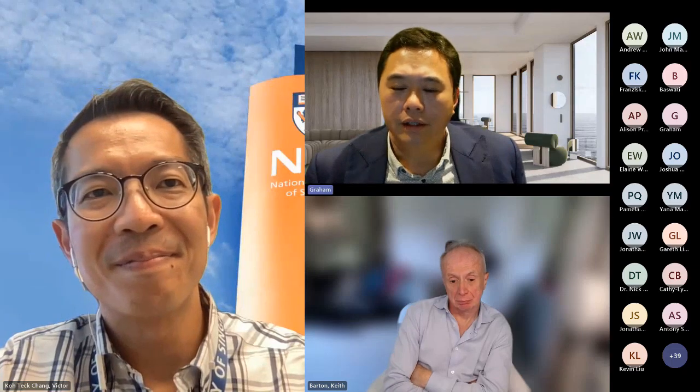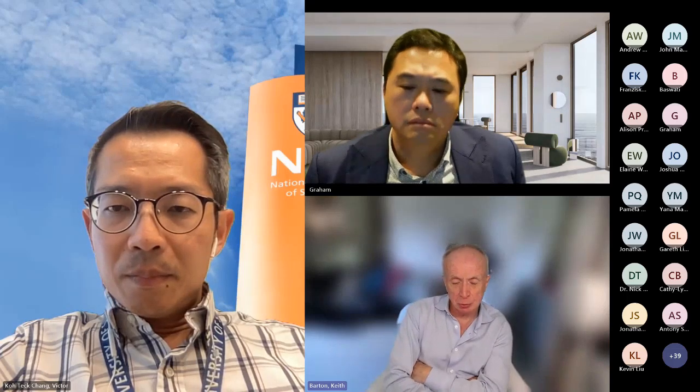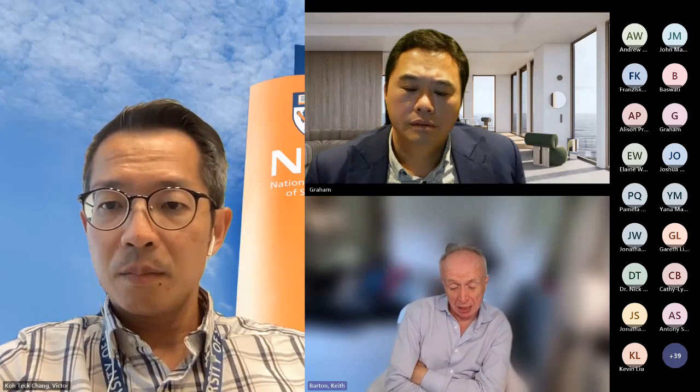Any other comments, Keith, Andrew? No, my only comment was, when the PGI first came out, my original concerns were, will it be as effective as a Baerveldt? It's great having a smaller tube, but will we be compromising the long-term success in some way by having a slightly different plate? And it's just encouraging that so far it doesn't seem to be any worse than the Baerveldt. The early pressures are more predictable, and the long term seems to be roughly the same as the Baerveldt, maybe marginally better, but certainly not worse, which seems encouraging.